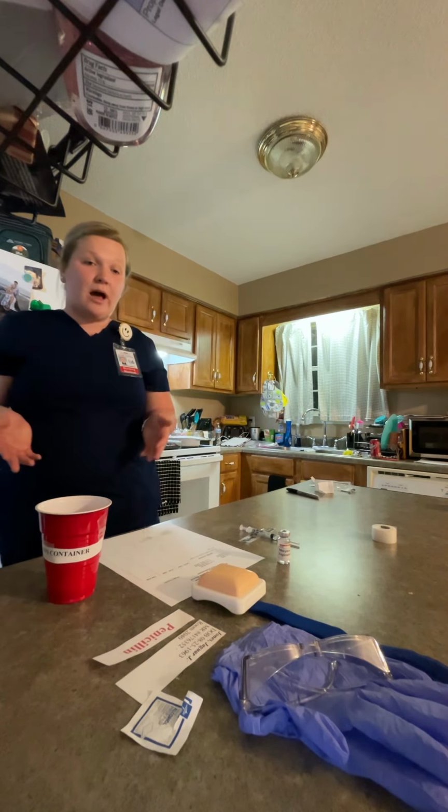I'm aspirating for blood. I'm going to inject it slowly. I'm going to put my needle directly into the sharps container, and I'm going to put my alcohol pad over the injection site for a second, not putting any pressure, and now I'm going to throw it away.